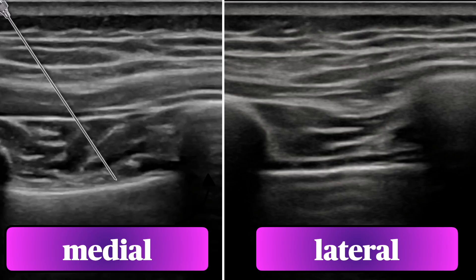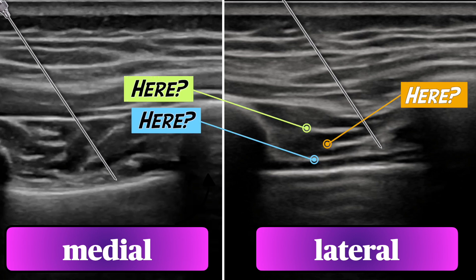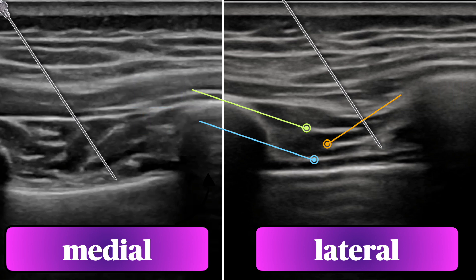Here's where your needle tip should end up to be in the correct plane with the nerve. It doesn't really matter which site you choose — you'll get the same clinical effect, and it's a matter of personal preference, convenience, and ergonomics. Personally, I prefer doing these close to the midline because it removes the scapula from the equation. I also prefer not to find a nuanced intermuscular plane with my needle where I risk putting the local in the wrong space. I'm happy to hydrolocate my way down to the pleura safely, then inject there — it's very reassuring to see the pleural depression as an endpoint, and I know the block will work.